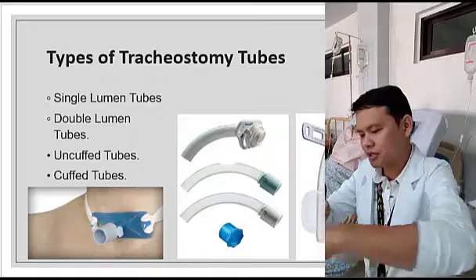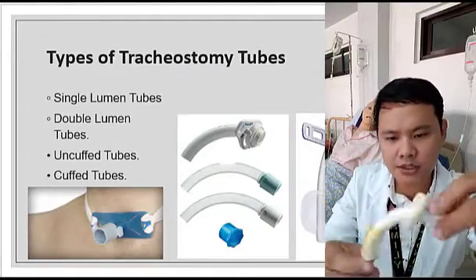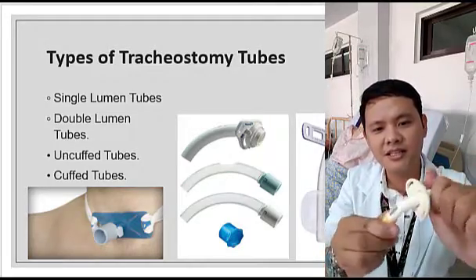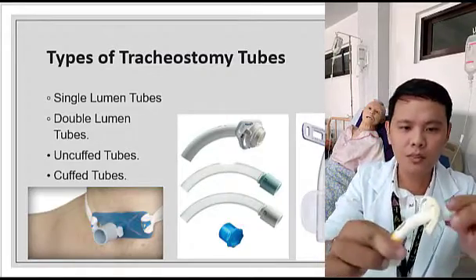Okay, let me show you something. Okay. Again, this is a double lumen tube. It is double lumen. Why is it called double lumen? Here's the other one. Okay, the inner tube.